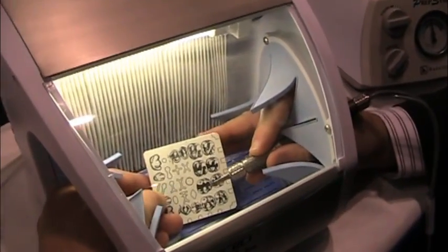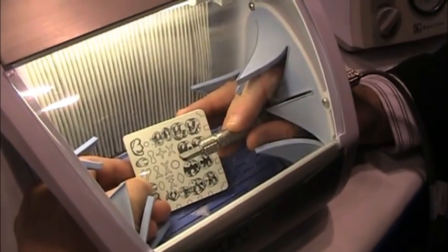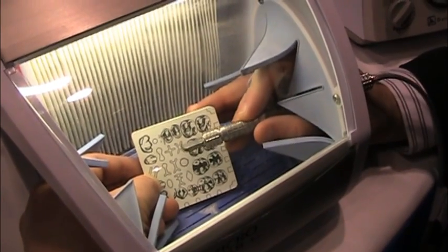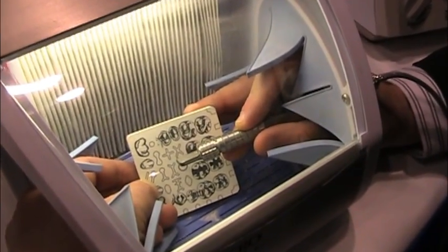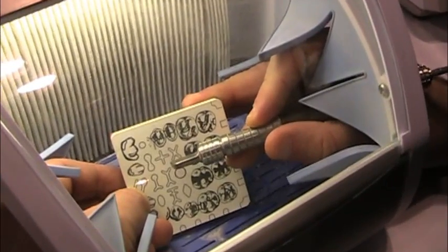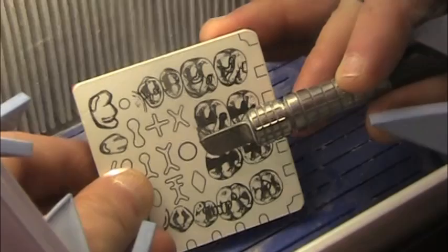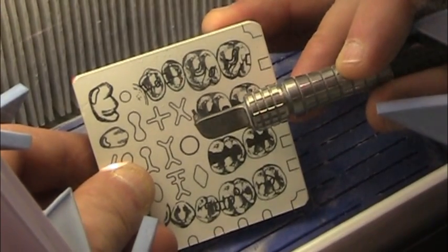For demonstration purposes, we have a ceramic block that has about the hardness of regular tooth structure, and I'm going to show you the accuracy that we can use the PrepStart H2O. So I'm going to activate it. First, I'm going to turn it on, and you'll be able to see the particle beam coming out of it.